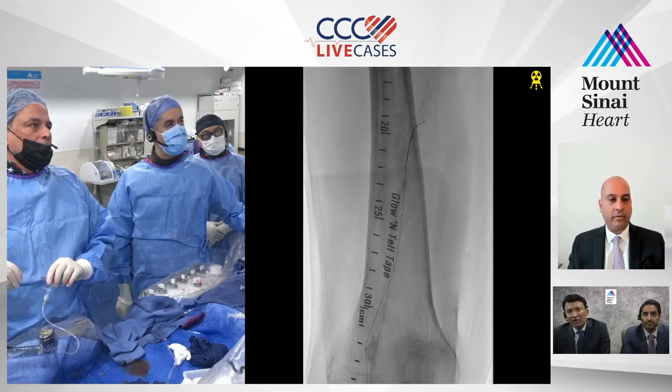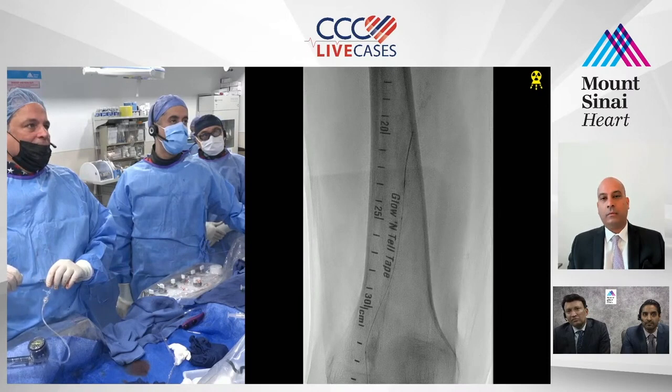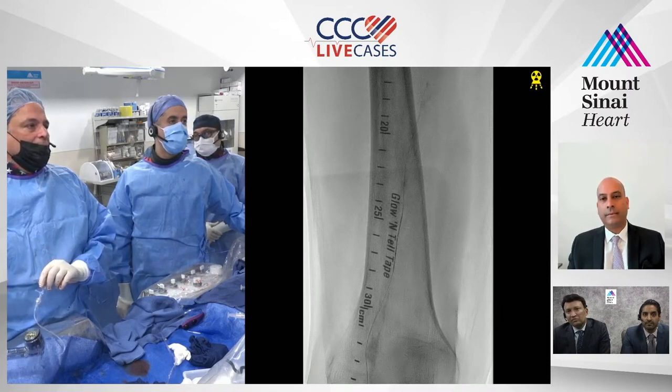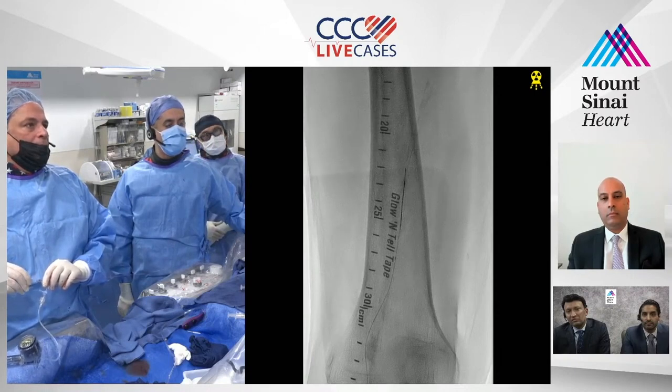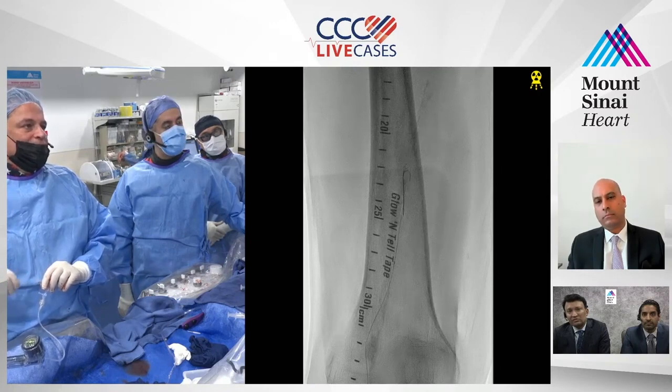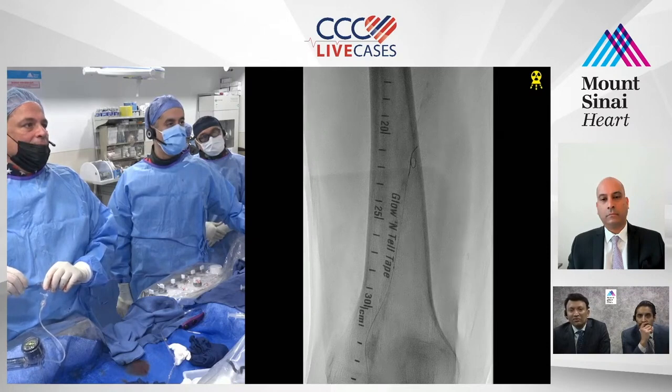PK, any reason you pull back? I just wanted to get a feel, but sometimes the wire can pop in. Is this a technique like ballooning when you know you're intraluminal to try to open up that true lumen so that you push that dissection flap back down? That's what I'm trying to do. Sometimes you'll get lucky, right? We're just trying to see whether we get lucky. We do frequently get lucky here in this lab.